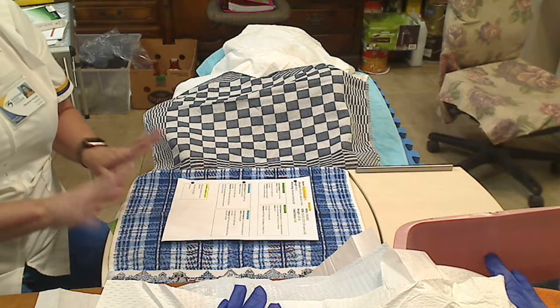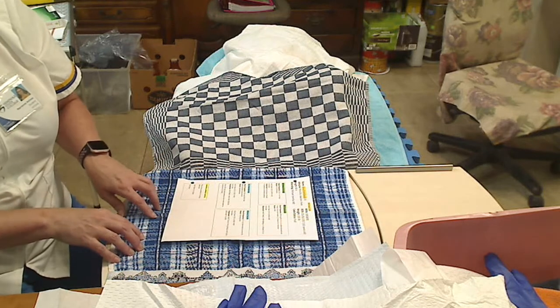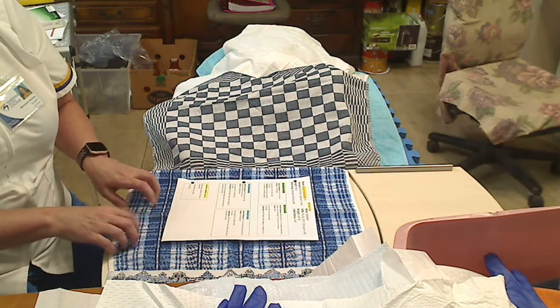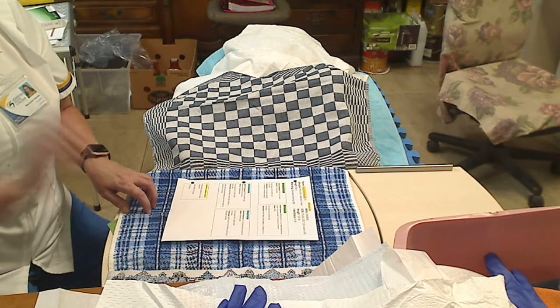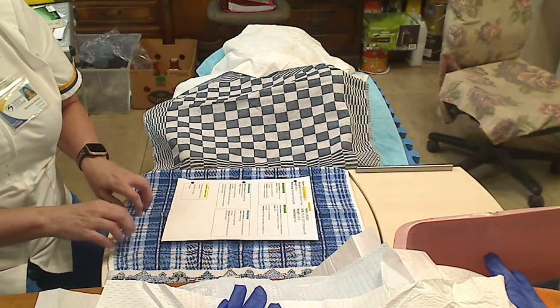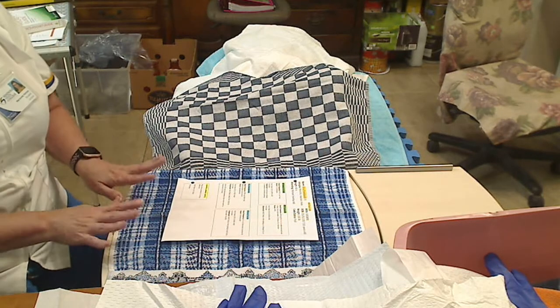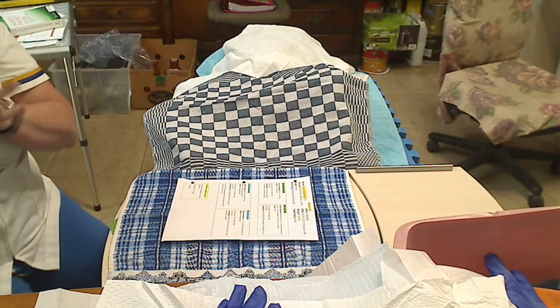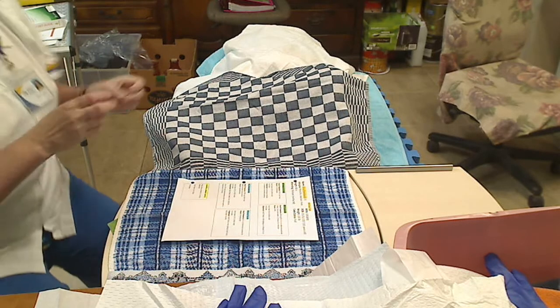I did not notice any odor while I was doing my procedure. The size of my catheter was a 14 French, and I did inject 10 milliliters of sterile saline into the balloon. Before I leave, I'm going to sanitize my hands again and ask her if there's anything I can do.